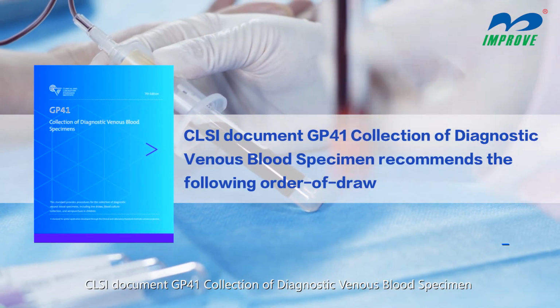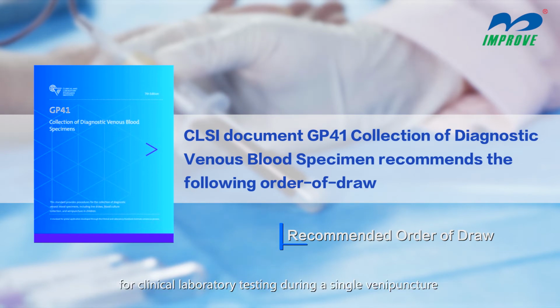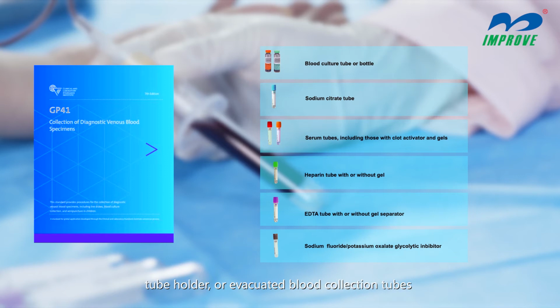CLSI document GP41, Collection of Diagnostic Venous Blood Specimens, recommends the following order of draw when drawing multiple specimens for clinical laboratory testing during a single venipuncture. The order of draw is the same for specimens collected by syringe, tube holder, or evacuated blood collection tubes.